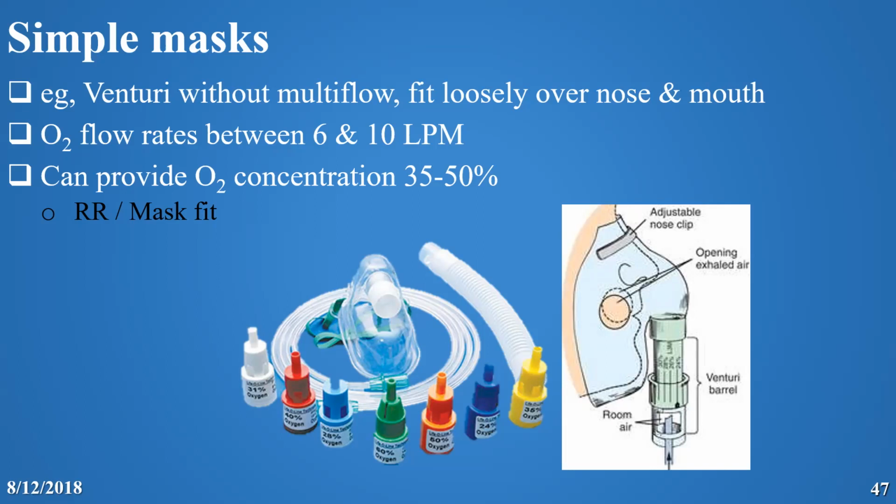Masks are not blended. This is only an oxygen delivery system. There is no blend here. This is only temporary, only for the beginning, until you decide what you should do for the patient. So if you need blending, it has to be nasal cannula, CPAP or high flow. That's the only way we blend. And if it's a mask, you cannot blend. You understand? Yes. Yeah, no blending here.